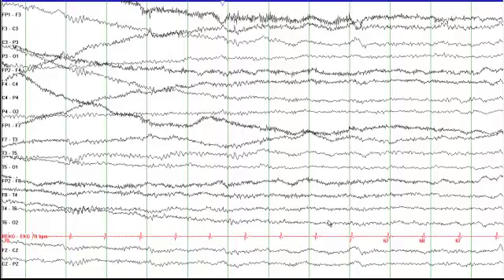Let's start with the clinical history. This is a 50-year-old man with altered level of consciousness for the past two days. An EEG was requested to rule out electrographic status epilepticus.